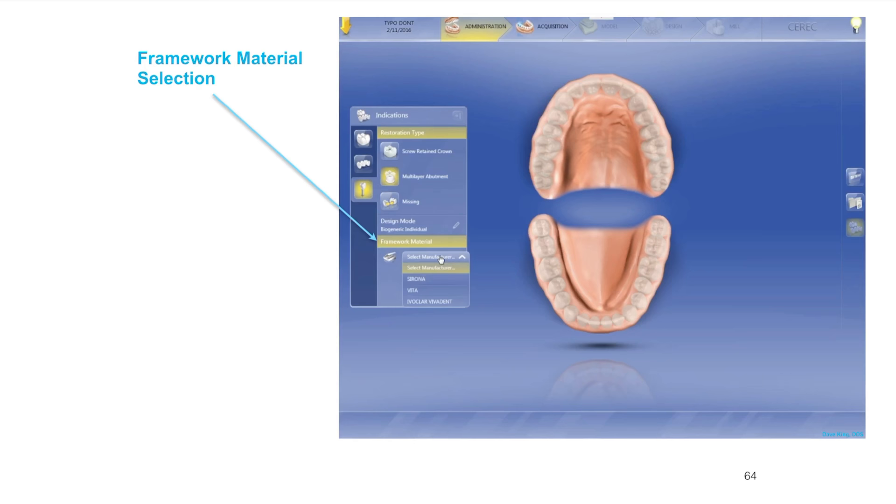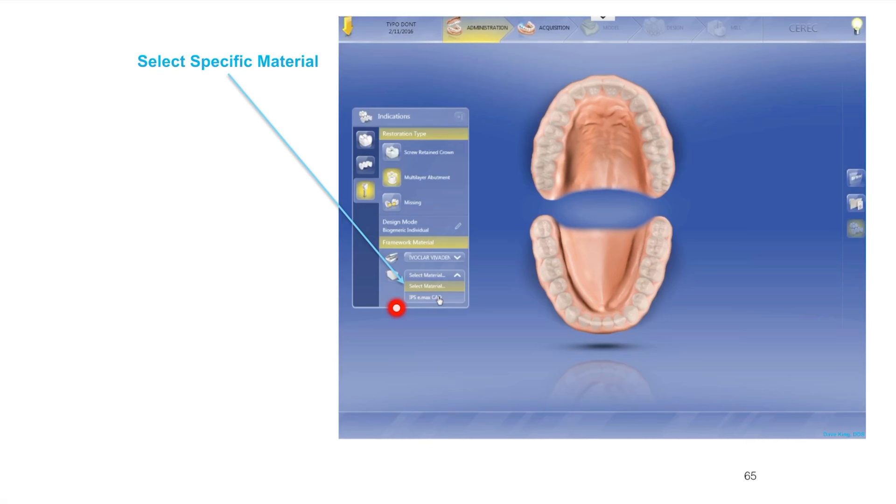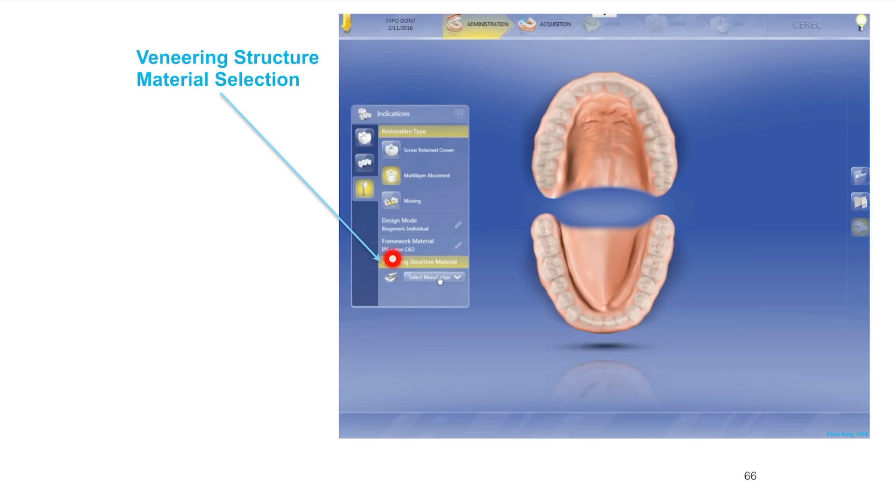The framework is the first selection, that's our abutment. For the multi-layer I'm going to select Emax. If you use zirconia you can certainly use zirconia. If you're going to use Vita Enamic you can use Vita Enamic. Just select the appropriate material for your framework.